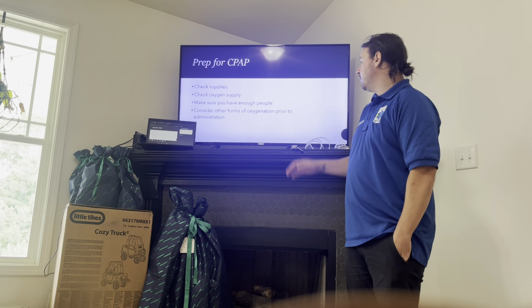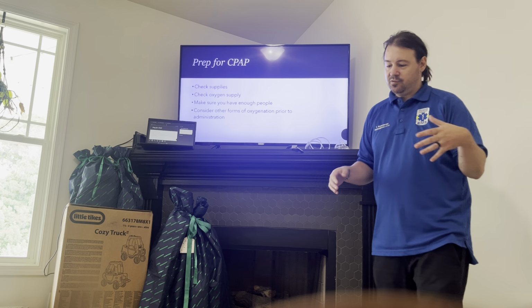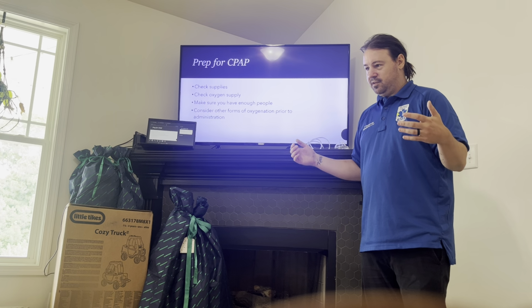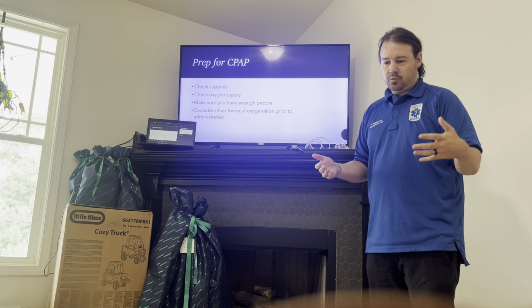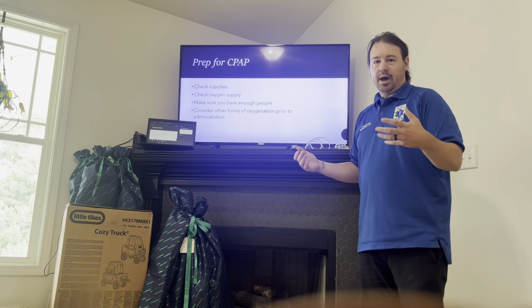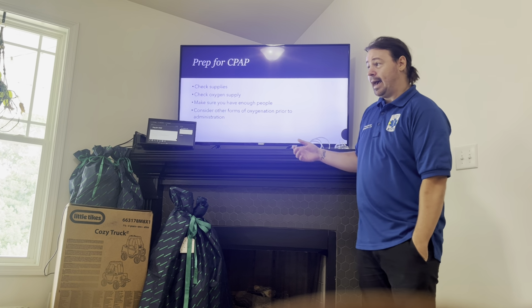Consider other forms of oxygenation prior to the administration. If during the setup process you look around and realize that we've got a lot to do to get this patient on CPAP, maybe they're in an uncomfortable area that's difficult to get to and we're not going to get a quality seal, or maybe we don't have enough providers on scene already and we want to wait until we have somebody else.